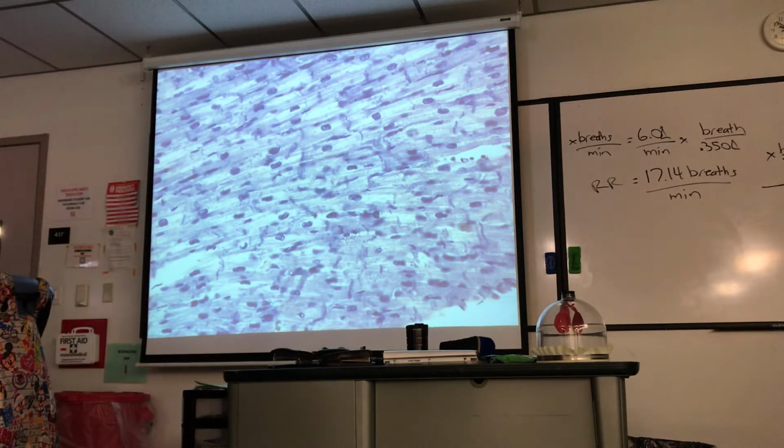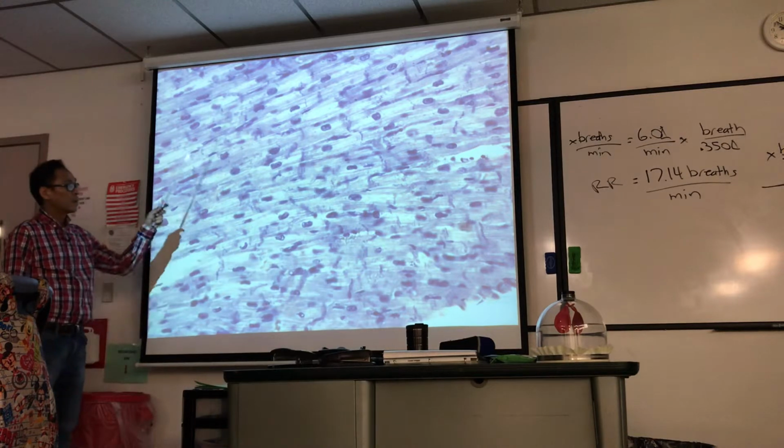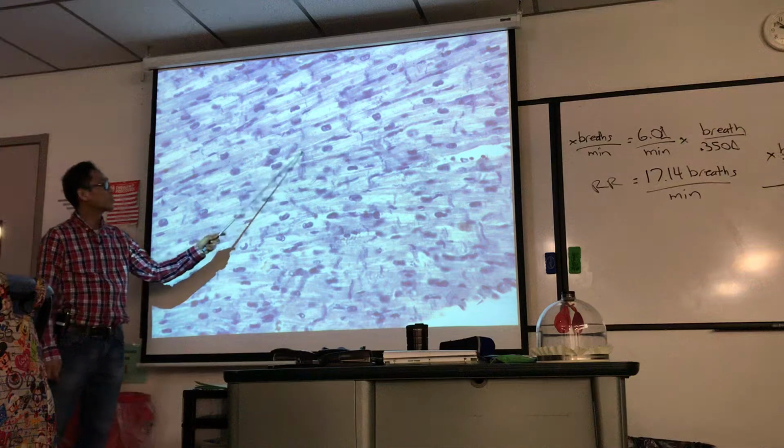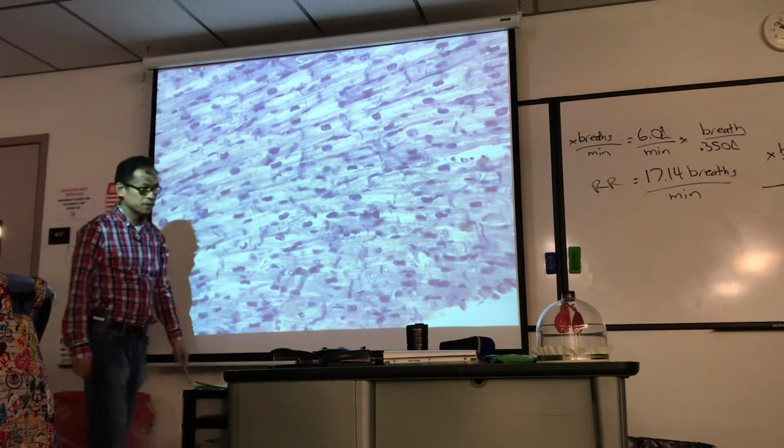Quick review. Identify tissue: cardiac muscle. Identify structures: intercalated discs.